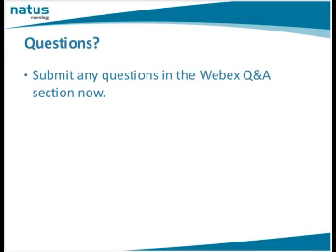Oh, one more thing, Aisha, before we go to the next question. Keep your power down when you're doing the extracranial ICA. So we usually use a power of 50% or less, because you're not going through bone when you're underneath the angle of the jaw there. So keep your power down probably to 50 or 60% maximum. I usually use 27% power.